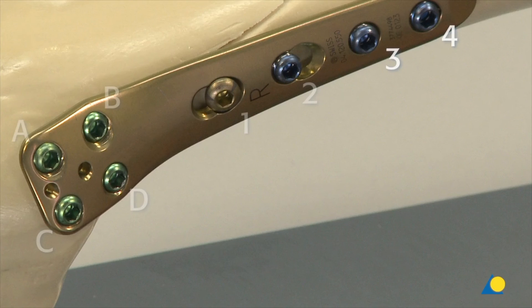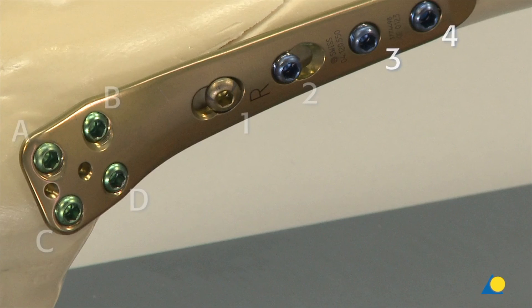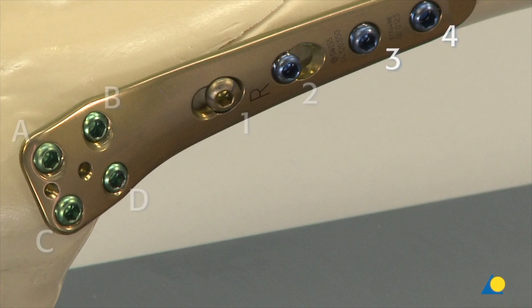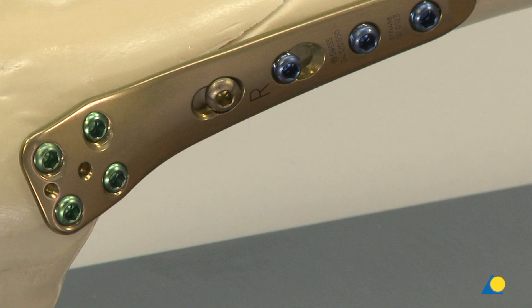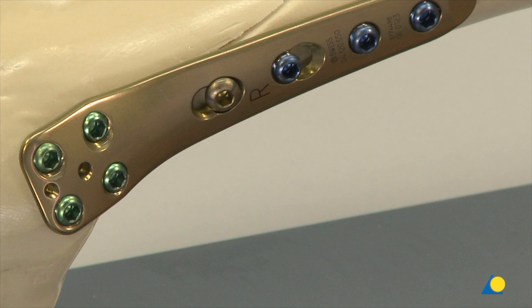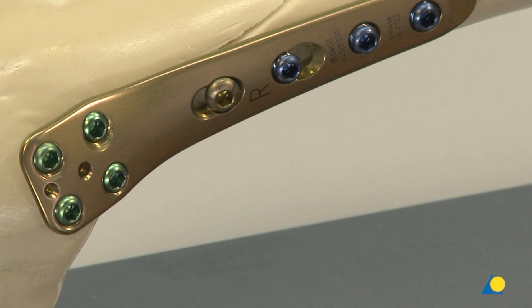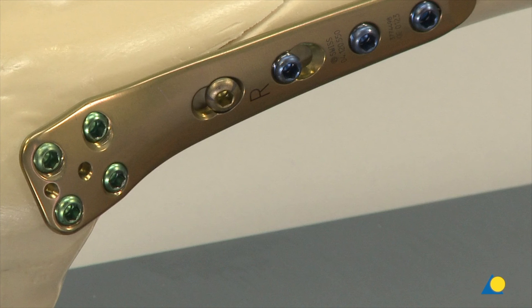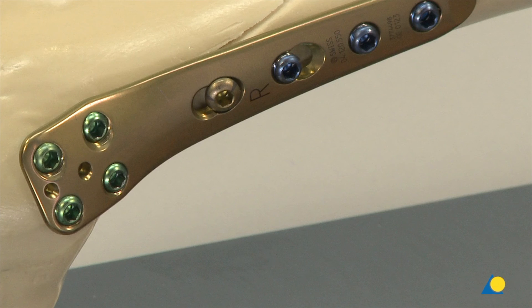Monocortical locking screws are also inserted into plate holes 3 and 4. Bicortical screws may be indicated in cases where increased stability is required, for example in patients with compromised bone quality or obesity.